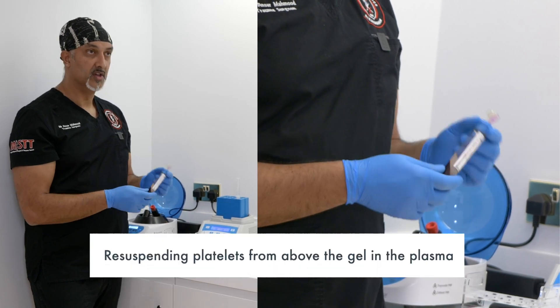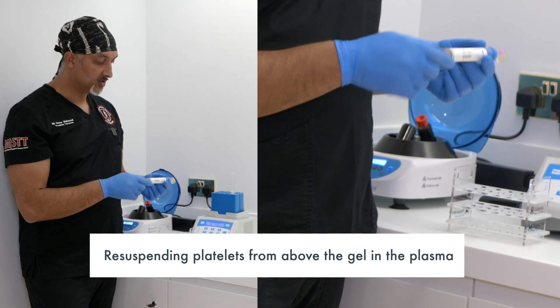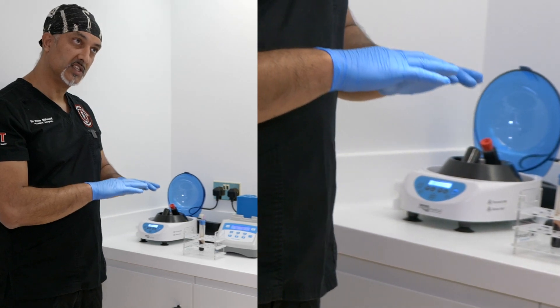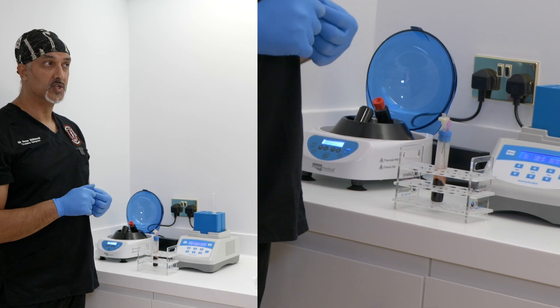That calculation only takes a couple of seconds — I do it a lot. Then you're going to leave this on the side and redo it because the platelets will settle again. That's the resuspension step. You have to know the product you're using.